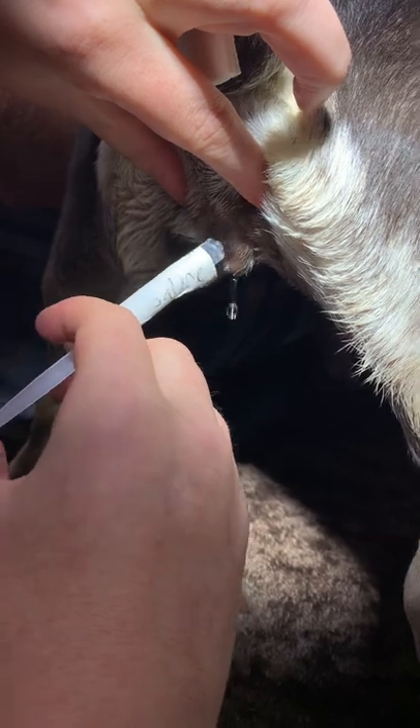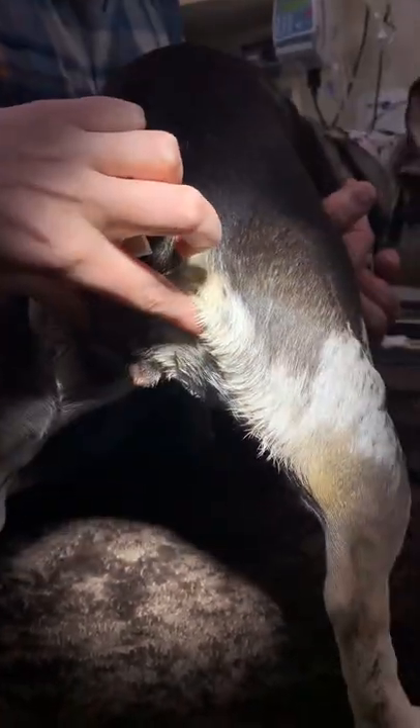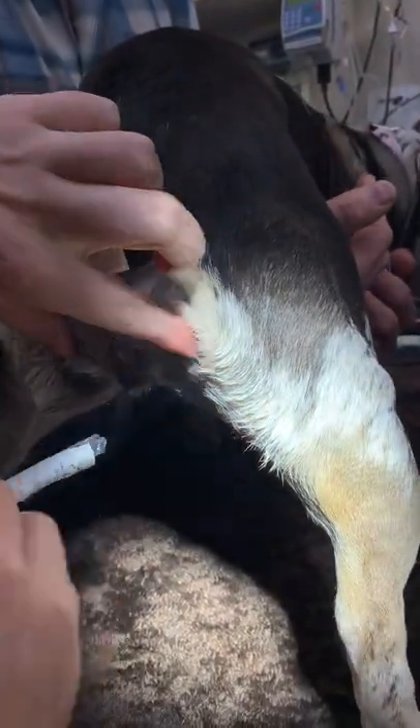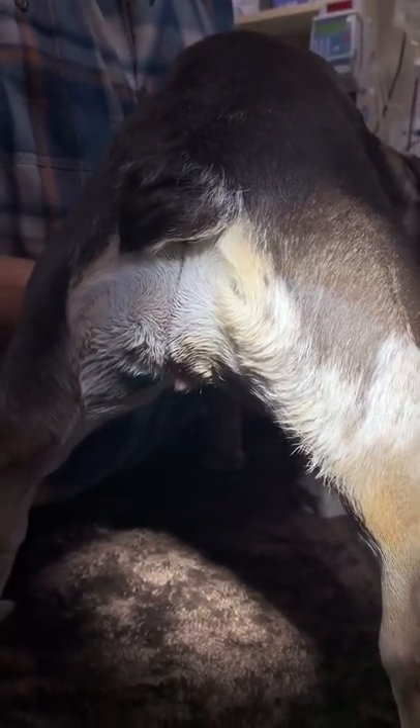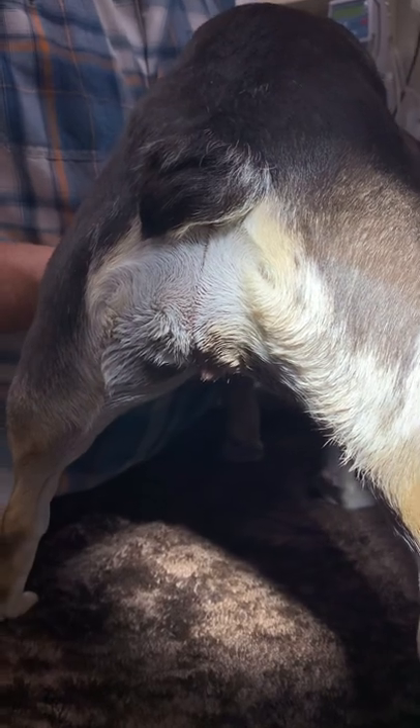She's just getting a bit of a flush here right now. So it's just the distal vulva — it's not the anterior vagina or the vestibule of the vagina. An important thing to note is that after you've done your prep, it's a two-person job. What you don't want is the dog sitting down after you've done your prep. So have someone just place a hand under her tummy.